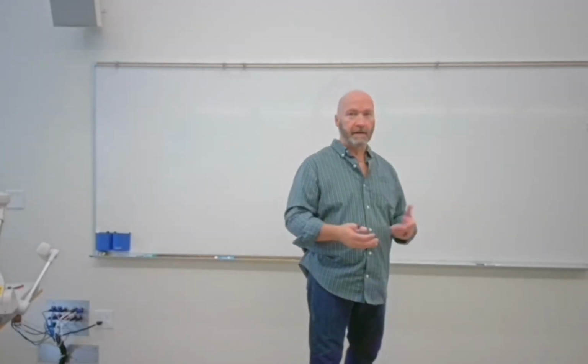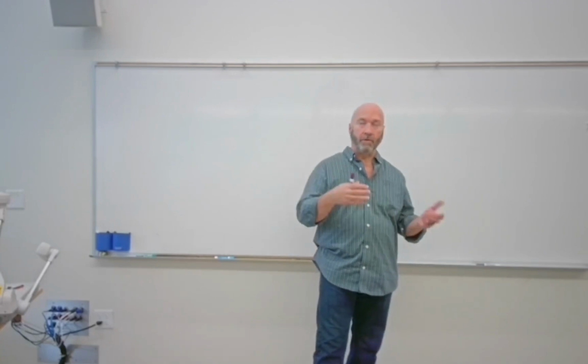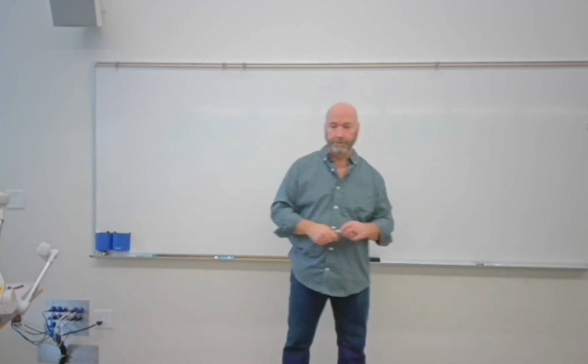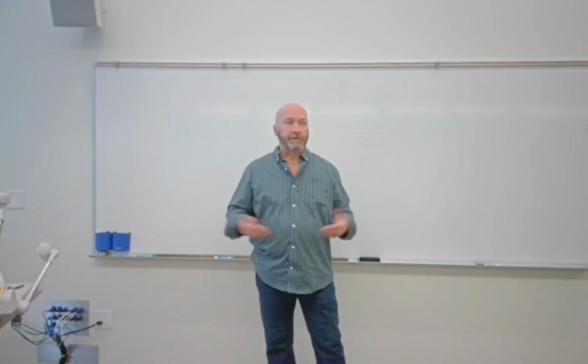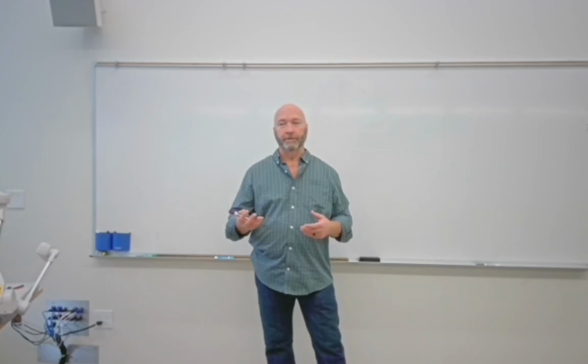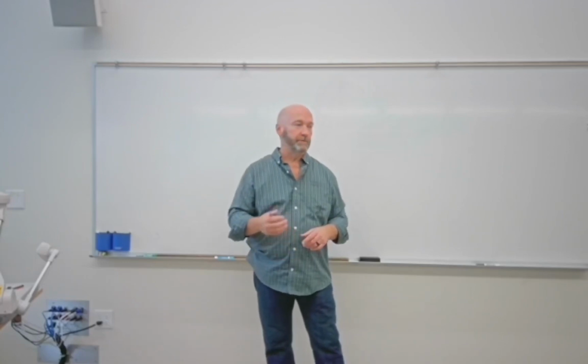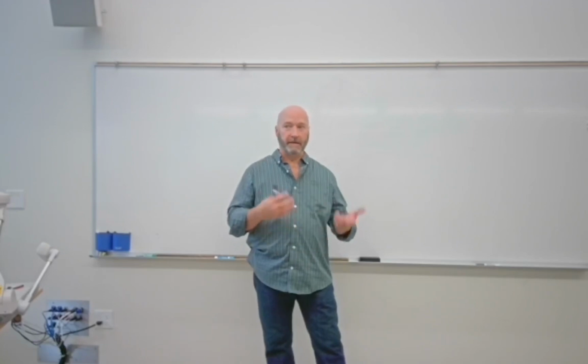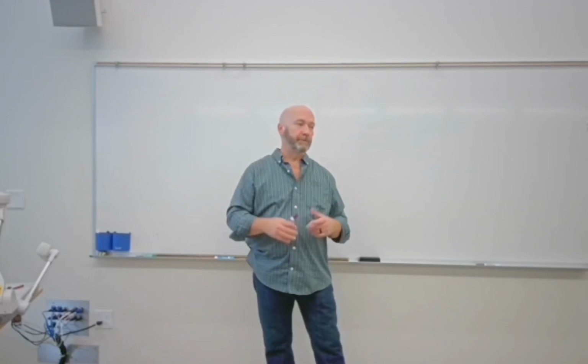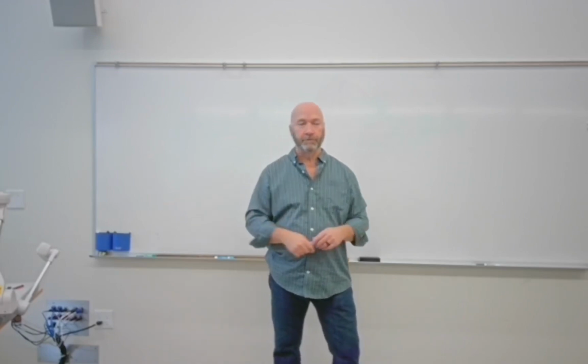They're general diagnostic or just RF or general diagnostic rooms. So we have to have something to put the patient on. You'll see that referred to as a couch. I think Bushong refers to it as a couch. Most people talk about it in the context of being a table. So if you see the word couch, that's what they're referring to as a table.